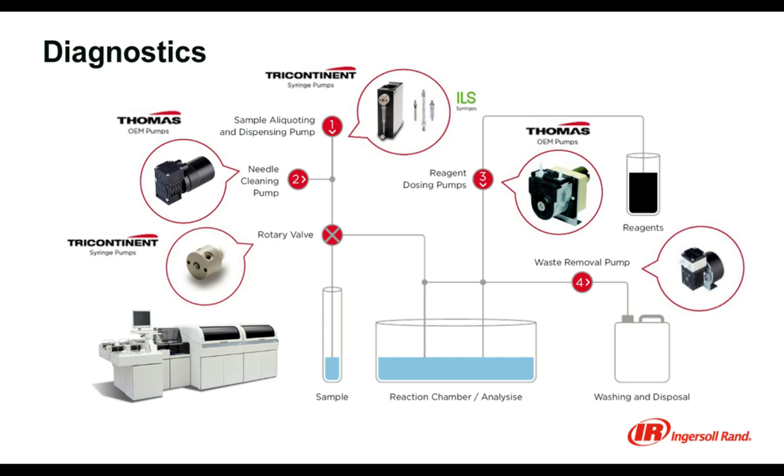Well, when you're dealing with ceramic valves, depending on the media being pumped, there can be issues with chemical compatibility that can result in the valve seizing. And also with solenoid valve technologies, there can be limitations because whenever the valve is turned on or off, a lot of times liquid can leak from that interface. And with that leaking and clogging that could occur, you can see contamination. You can see leaking within your system, which of course is not ideal.